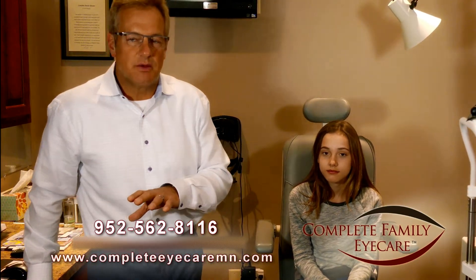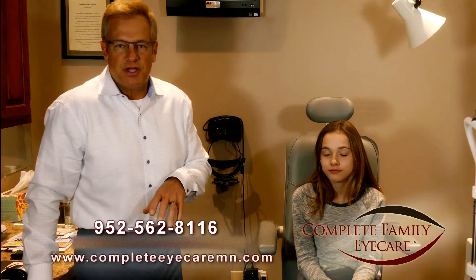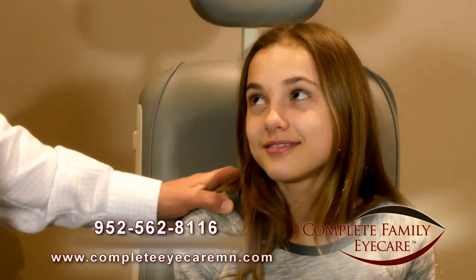I'll show you the device we use to screen you for glaucoma and check the pressure in your eyes. It's much more patient friendly and much more accurate — so patient friendly that my 10 year old daughter, Isabelle, has volunteered to be our patient here today.